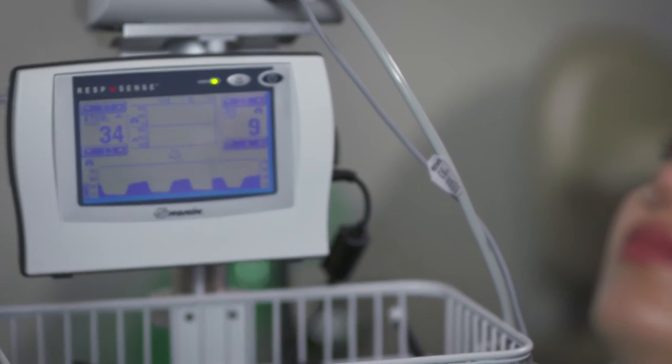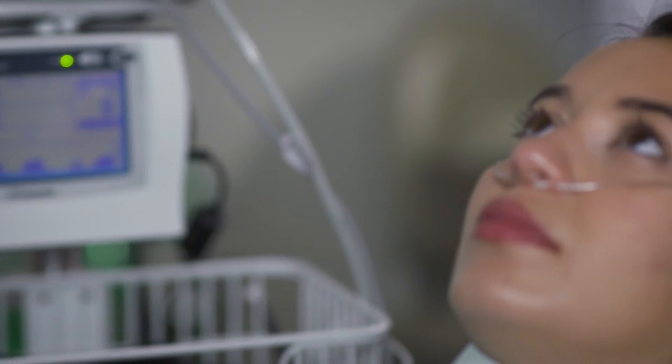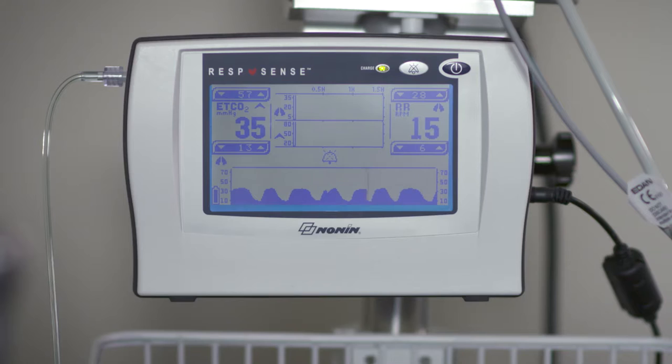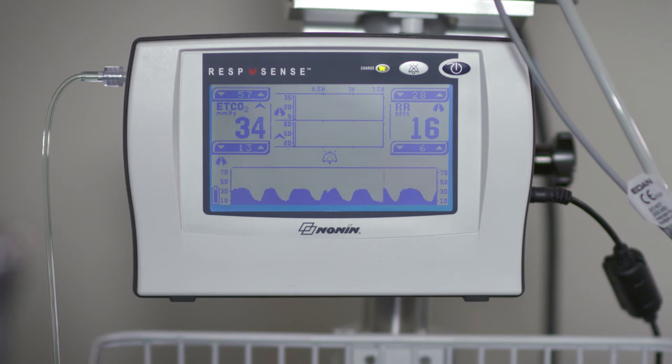Capnography works by sampling exhaled air through a small tube such as a cannula or a sample line during a procedure. The amount of CO2 in the exhaled breath is analyzed by the monitor and reflected in a waveform and numeric value that are displayed on the monitor or capnograph.